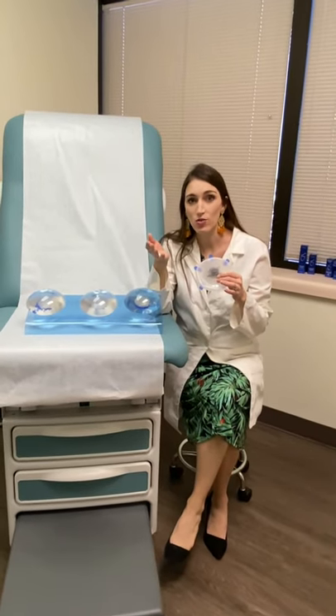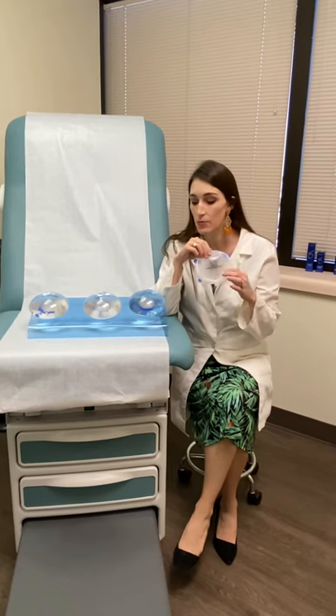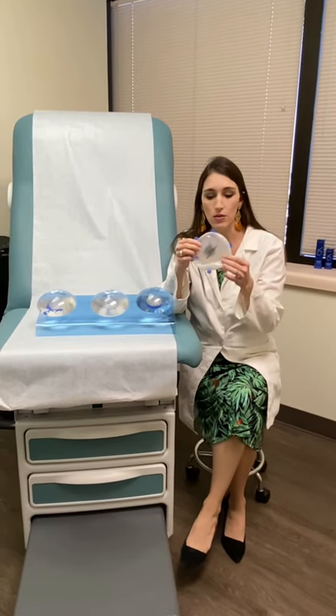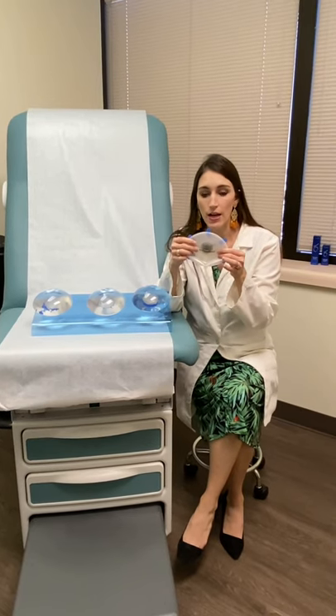One of the ways to perform breast reconstruction when ladies have had mastectomies for breast cancer is by using a tissue expander and an implant. This is what a tissue expander looks like. I compare it to a water balloon — it's empty right now.